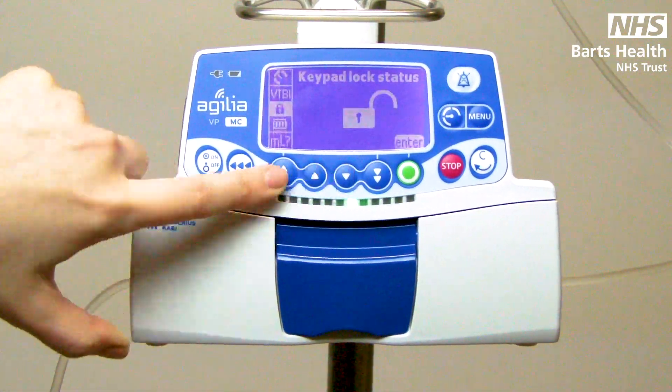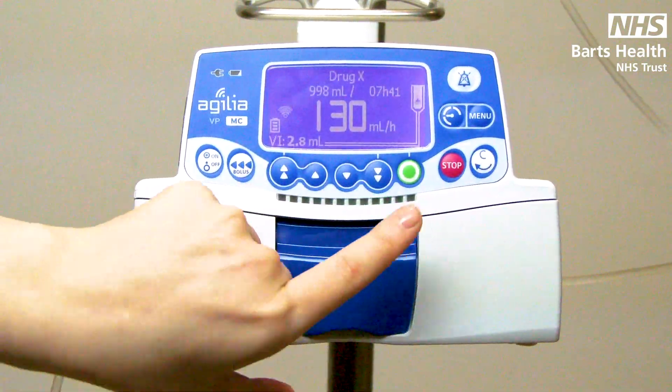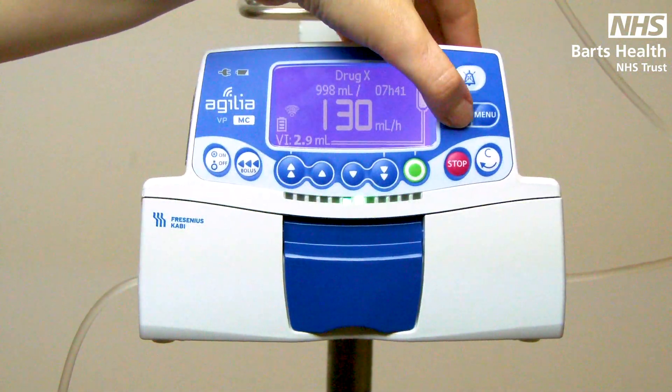Volume to be infused, keypad lock. Again, you have the shortcut to your pressures page with the button on the side.